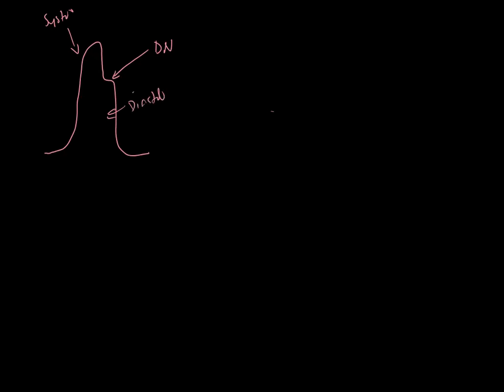Remember, any invasive line, if we transduce it, where does the transducer need to be? Level with the right atrium at about the fourth intercostal, right? Fourth IC. And that's known as the phlebostatic axis. Good.